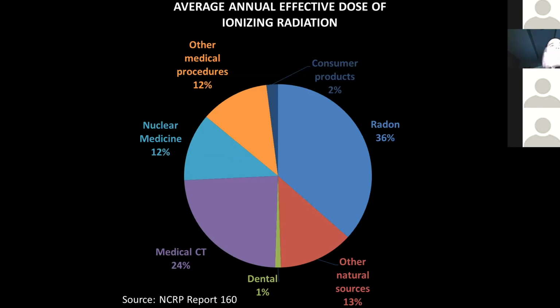If you read through the rest of that document, you'll find that there's a lot leaned on clinical findings and professional judgment. So the workflow again is you have something you found clinically or something you want to achieve clinically, and you order the image specifically for that. Next question.